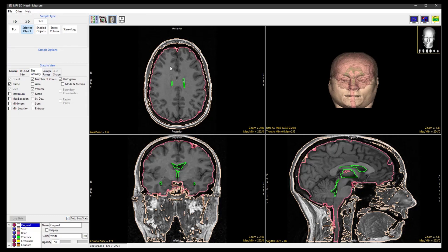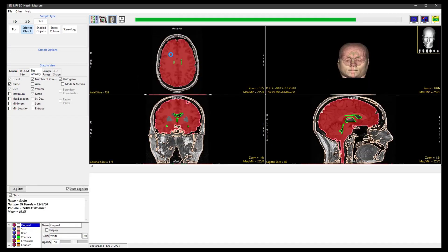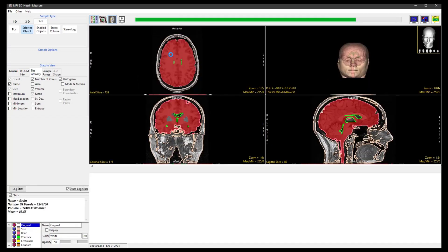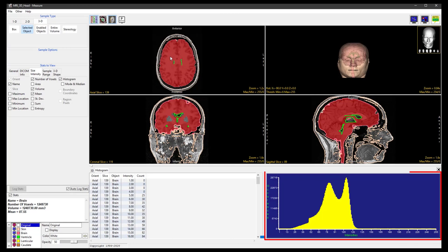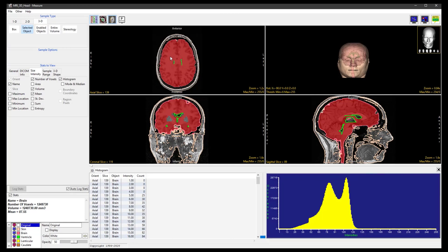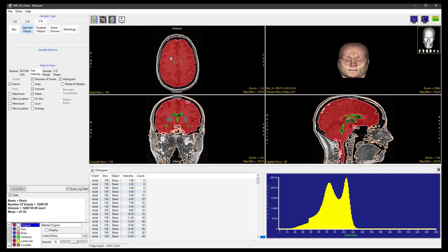To generate the histogram, click on the brain object in any of the three orthogonal slices. The histogram for the sampled object will be shown in the display area, and the intensity and count information will be displayed in a histogram tab in front of the other statistics tabs. The histogram information can be saved as a .csv file by right clicking and selecting Save Log.